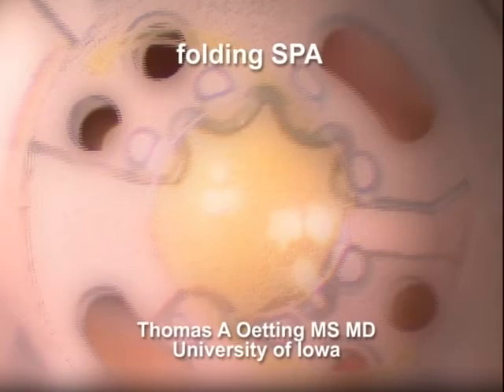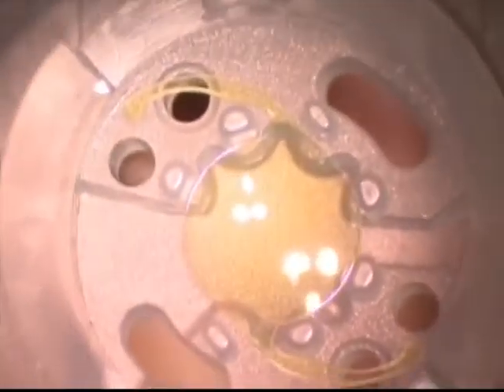Let me show you how I like to fold a single piece of acrylic intraocular lens. Most important thing, of course, is making sure it's right side up. When it comes out of the package, it's right side up, but I like to just confirm that by comparing it to the picture on the back of the cartridge. You want to make sure that it's folded the right way.